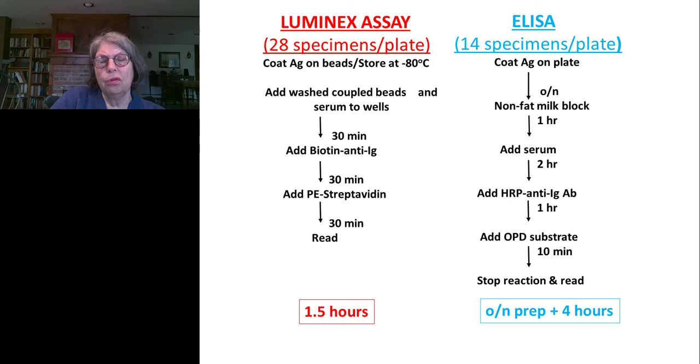And you do the RBD analysis and the spike protein analysis simultaneously. So within an hour and a half or 2 hours, you have the information on 28 specimens in the plate in just under 2 hours.